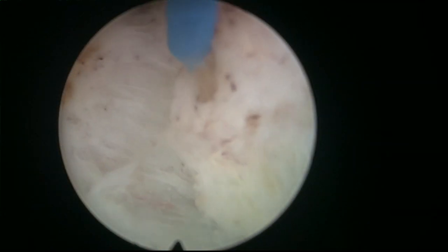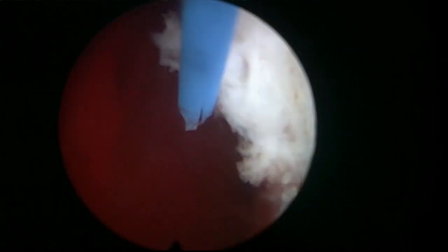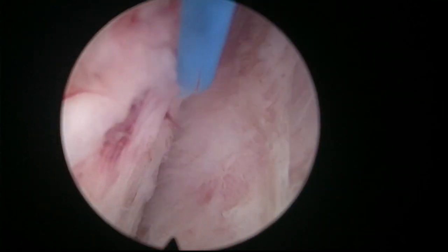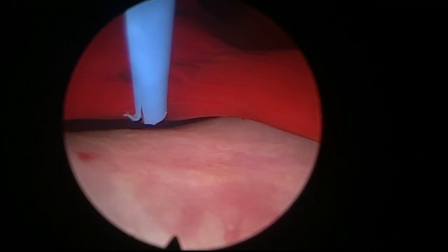So here I'm liberating a little bit the lateral aspect. See the very careful movements, but as I get here near the UO, we have to be careful. I will cut more into this edge. Sometimes we are very, very close to the UOs. But this way also, what I'm doing is I'm making the hinge, the pivot of the rotation of the adenoma, very narrow. If you need to rotate the adenoma with this bladder neck still attached here, it's going to be very difficult. But if you make it narrow, then it's going to be much easier.